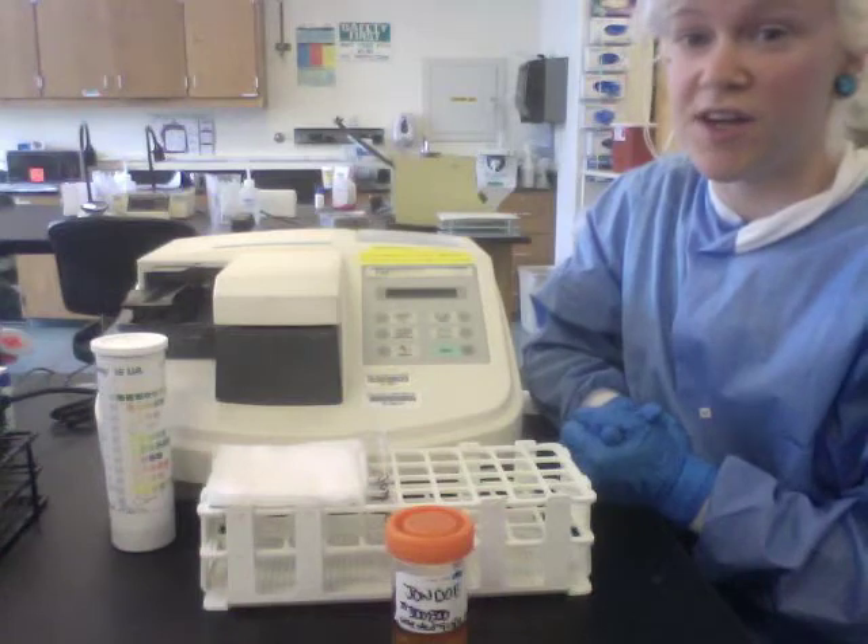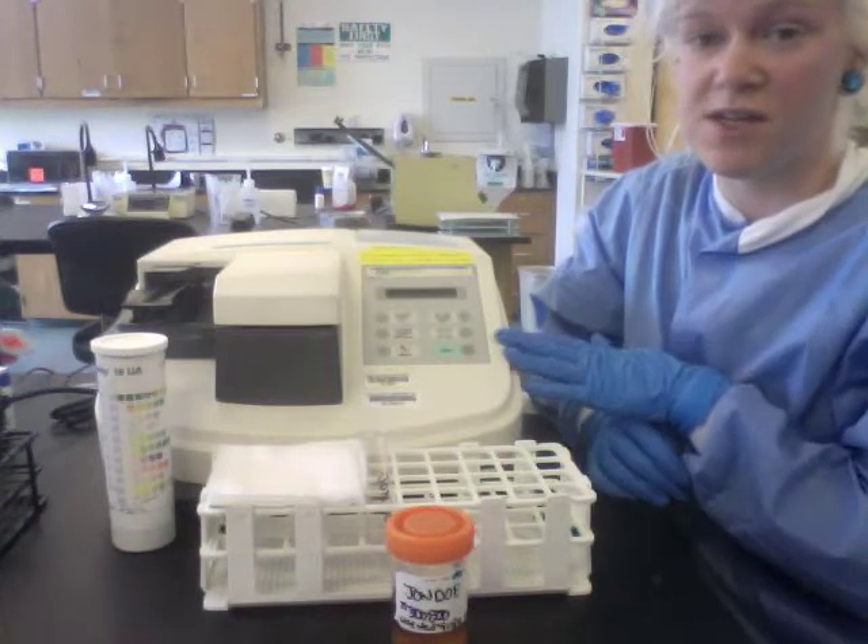Alright, so I'm going to show you how to run a urine specimen on the Criterion Analyzer.